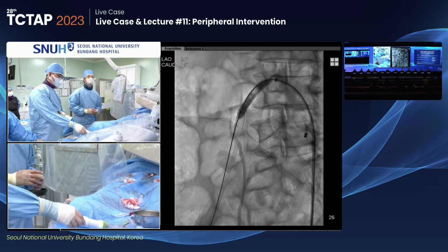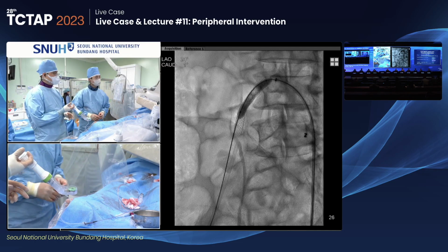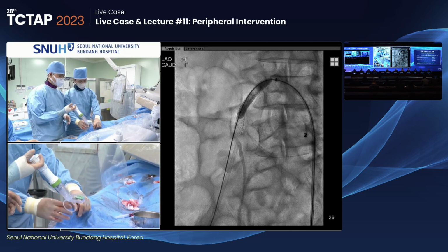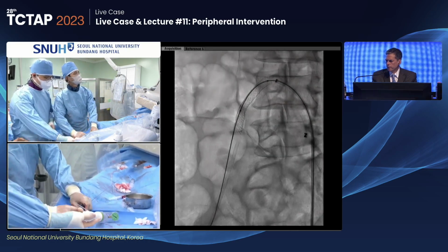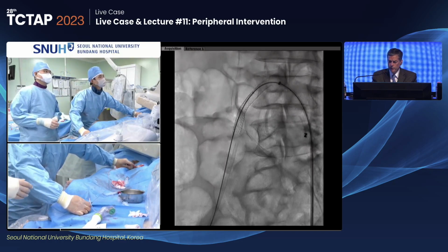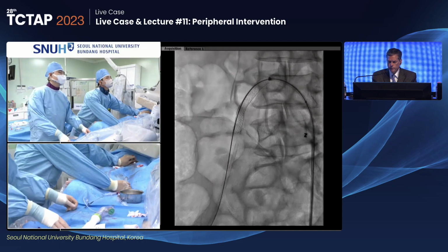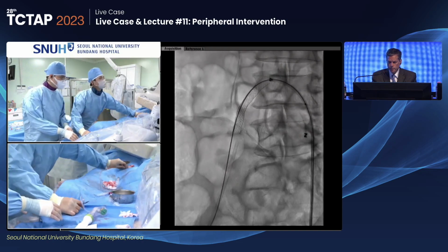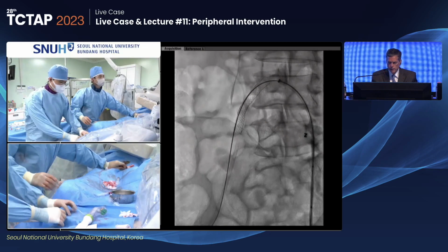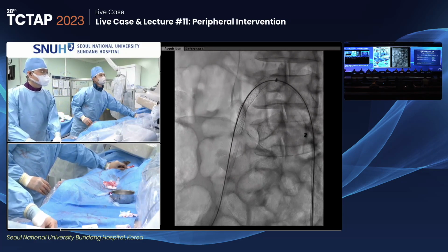Deflation. Do you think we need more bigger adjunctive balloon application in this patient? No, no. I think at the end of the day, it's perfusion and pressure, and it's going to help their leg out a tremendous amount. Then if it fails by restenosis, you have a whole myriad of things you can deal with. But right now, you've got what you need, which is flow again. Okay. I suspect that this will work very nicely for the patient. I hope so. I'm pretty sure.